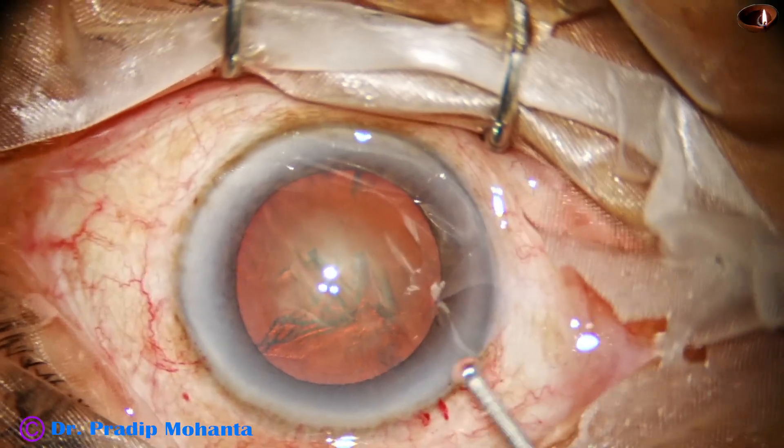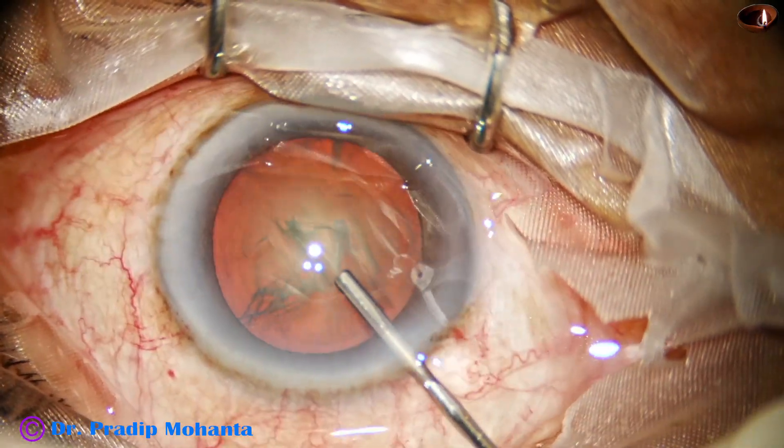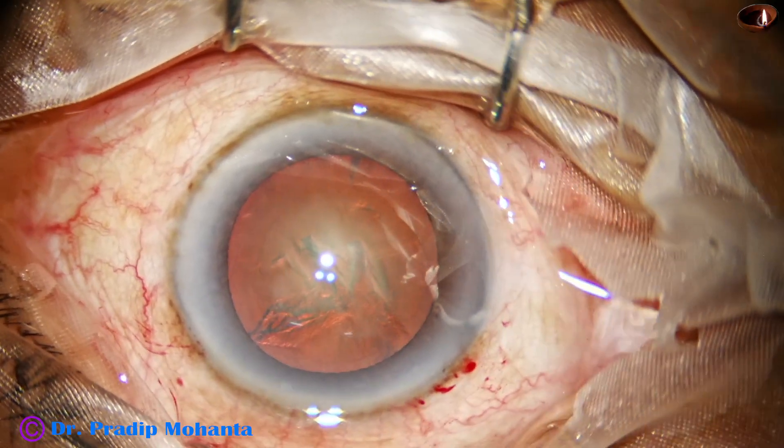If you would just lift off the anterior wall of the main wound, the chamber remains stable.